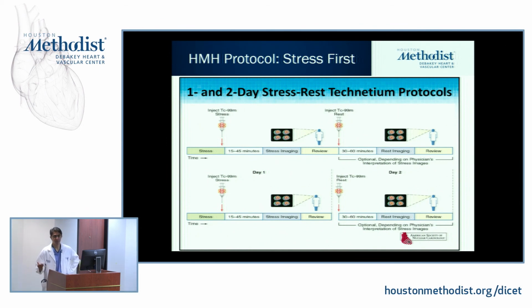As you know, there's been a big study that was published from our site. Dr. Chang was the first author, basically showing that there are a lot of advantages with stress-only imaging. First, when you compare it to a patient who receives stress and rest imaging, there's no difference in long-term prognosis. So that's one very important feature.